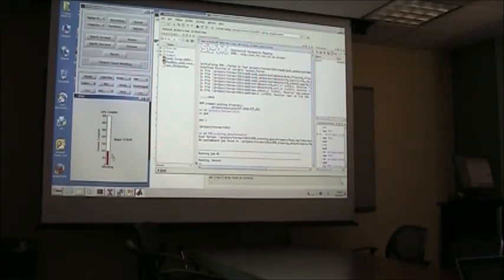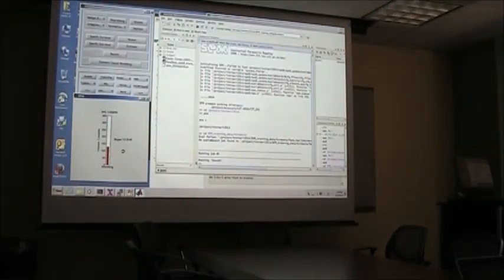SPM used to show a bar like this, saying how far it has run. But you'll also read that the argument for smoothing is because of anatomy. One person's gyrification is not exactly the next person's gyrification, but the smoothing helps to reduce that variance a little bit. Yeah, that is true.